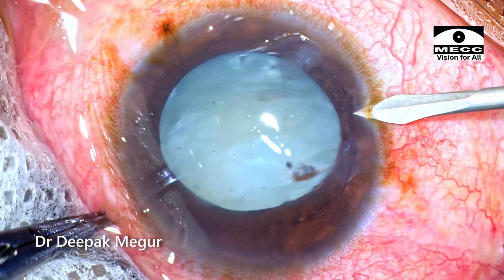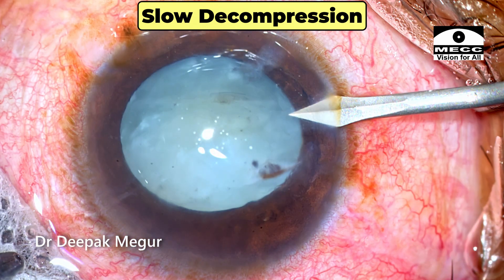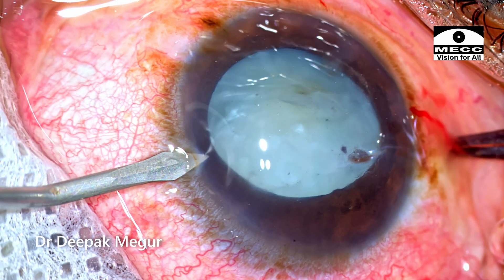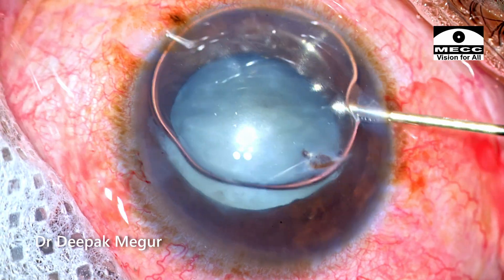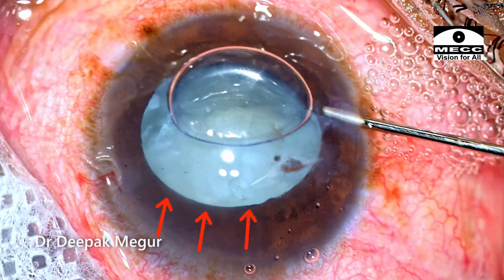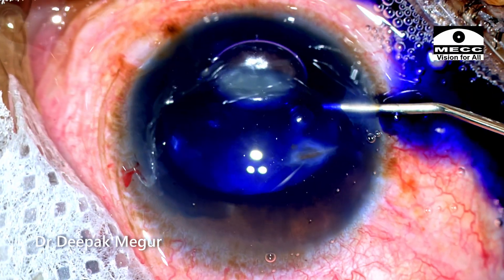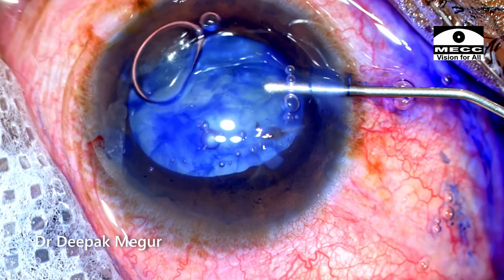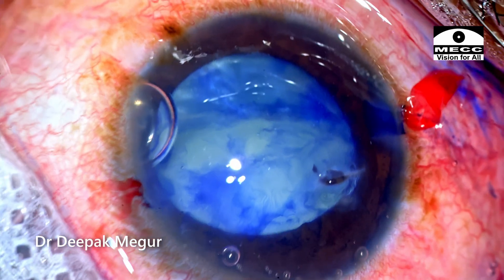While making paracentesis, I'm extremely careful to ensure very slow decompression as I'm dealing with a tense eye. I'm trying to push in some air — the superior temporal region of the anterior chamber is very flat and air is refusing to form that part of the chamber, and then the dye is squeezed in. After washing off the dye and pushing in dispersive OVD, the chamber deepens a bit but the visibility is still not great.